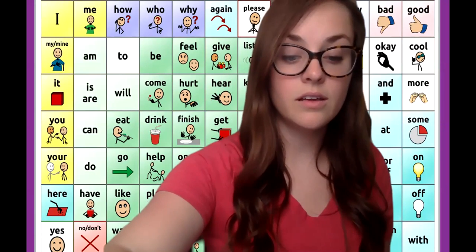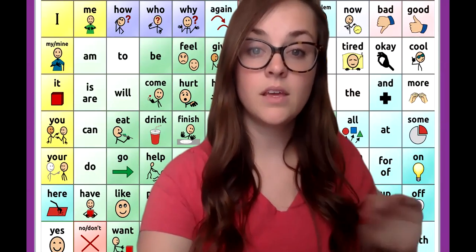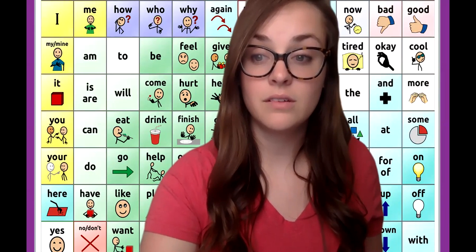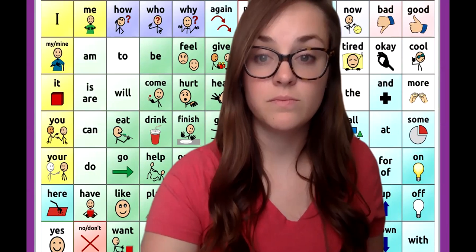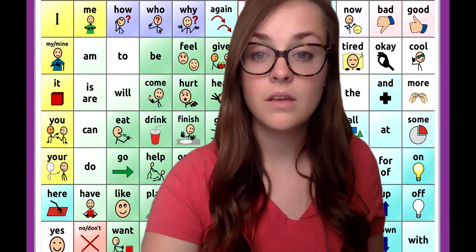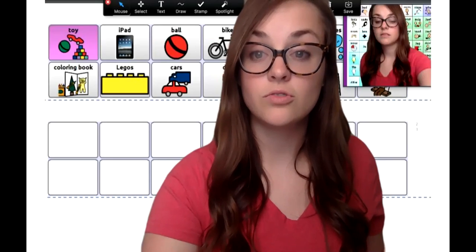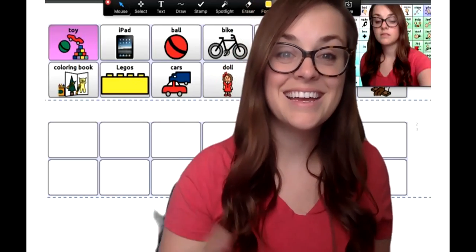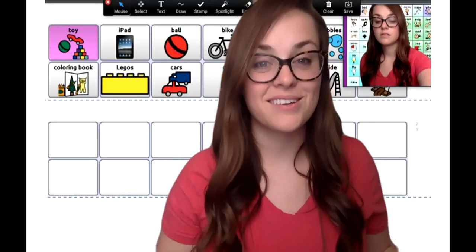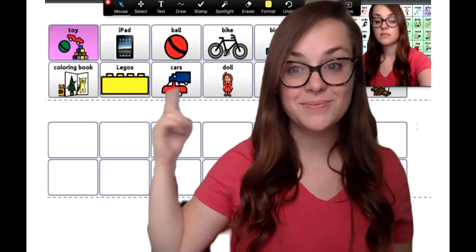Another shortcut is on a MacBook, all you need to do is Command-comma to get into your settings. And when you press V, it actually takes you to your virtual background. Unfortunately, I'm not sure what the shortcut is for Windows at this time. Then you're just looking for the slide that you made and adding it to your virtual background, and then it's behind you. Because I was in the video, I'm on there, but you will not be on there when you're doing it. So then you have your board behind you.